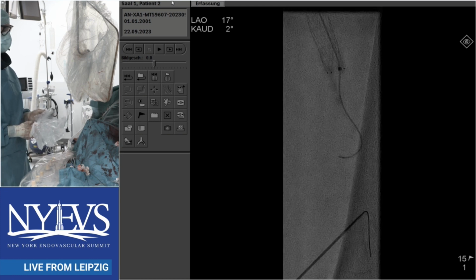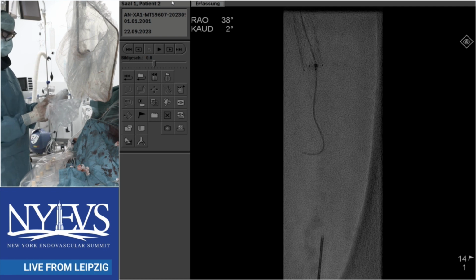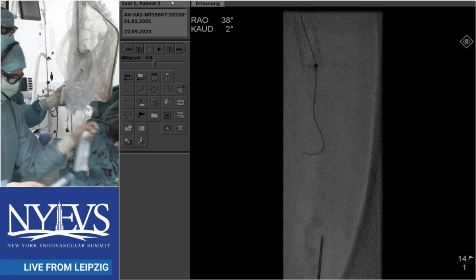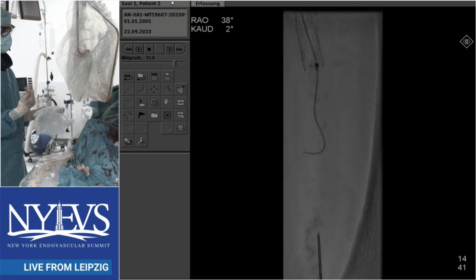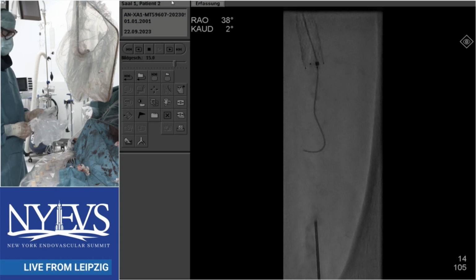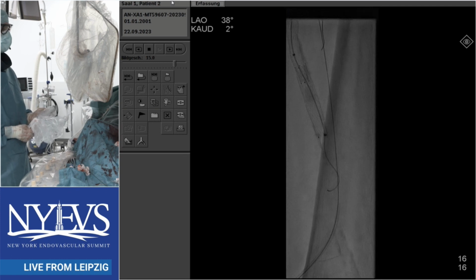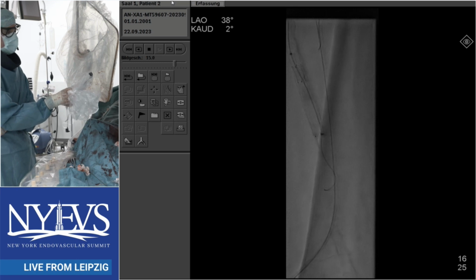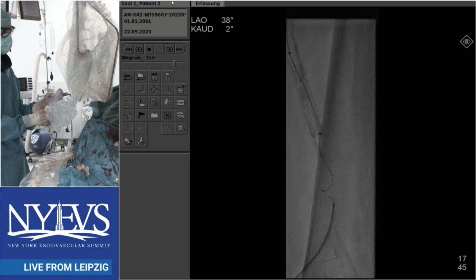So we went down to that segment, but we couldn't re-enter from the stent into the open segment. And I didn't try very much from above. You can also see that this wire takes quite a loop here. This is obviously the anastomosis of the bypass. So we punctured here, went in here, the wire went in here but then upwards, and the wire always went into the bypass. So we tried with the CTO wire.